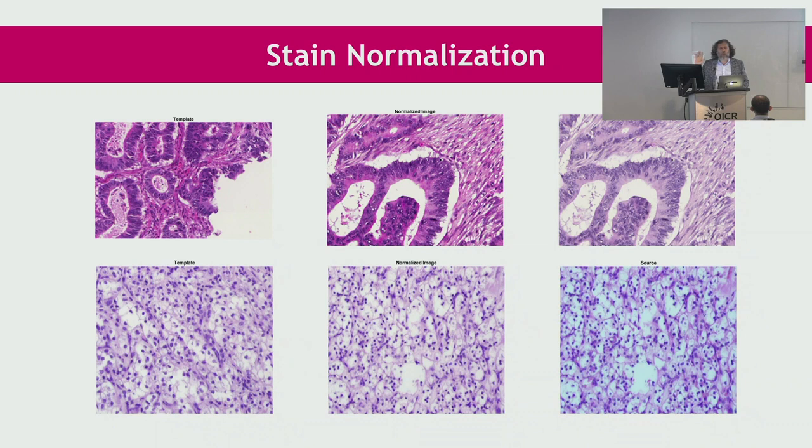The colorization of my image should look like this. And then the second one, the last one is the source. The first one on the left is the one that you say it should be like this. The last one on the right, the last column, should be the images that you get. And the middle one is the one that you adjust. So you normalize it to become what you want, or you normalize it to a certain level. So you can create consistency.